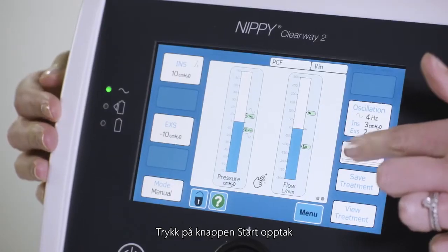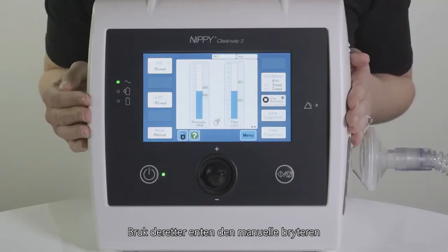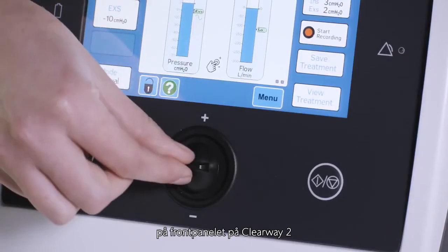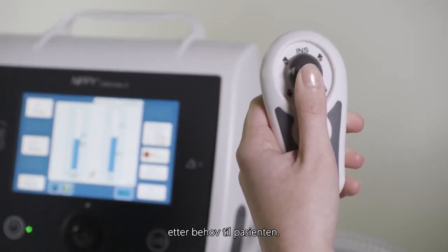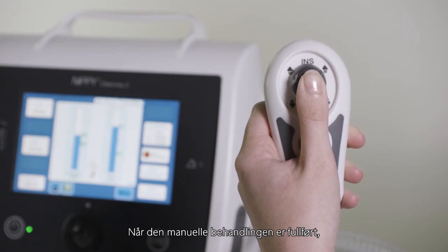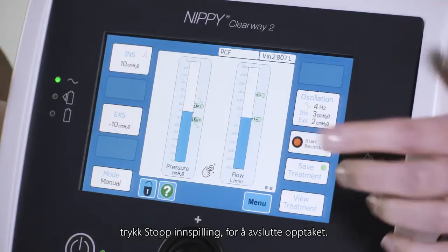Press the start recording button in the middle of the screen on the right side. Then, using either the manual switch on the front panel of the Clearway 2 or the handheld control, deliver treatment as appropriate to the patient. When the manual treatment is complete, press stop recording to end the recording.